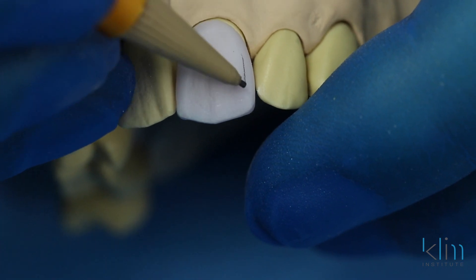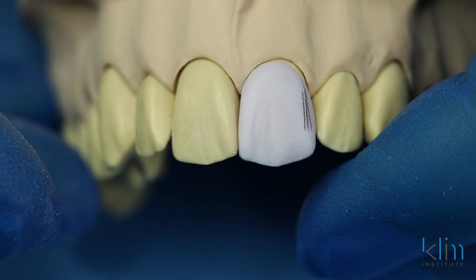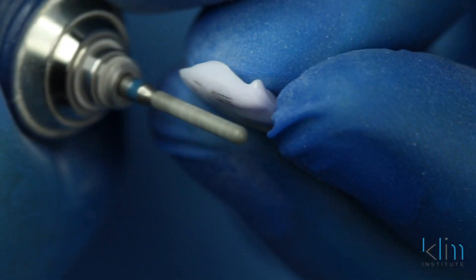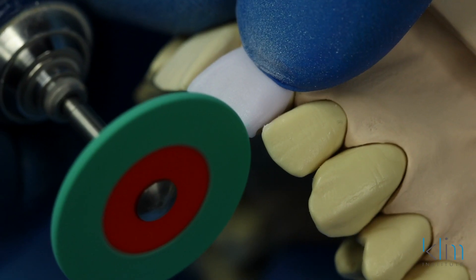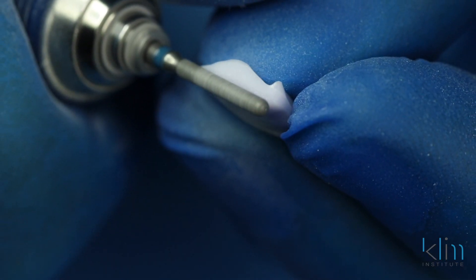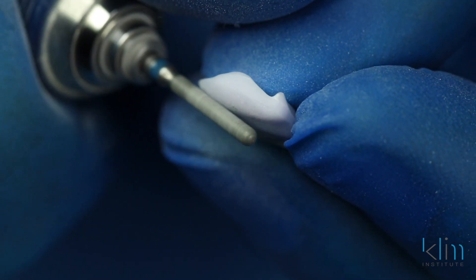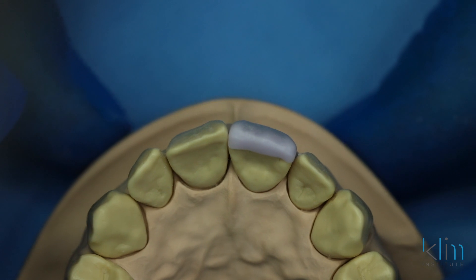One thing interesting about this case is that the mesial-distal width of this central is larger — the central was slightly retroclined, so we're bringing it forward, giving more room to fill with ceramic. In a case like that, keep the midline pretty much a mirror image and make up the difference on the distal. Maybe roll the distal incisal line angle more around the edge of the tooth. There are a lot of ways to make it look harmonious. I'm not as concerned about symmetry with the mesial-distal width overall — I want symmetry on the mesial of a central. The distal can have some variety and it's going to look really natural. We just want to avoid visual tension.